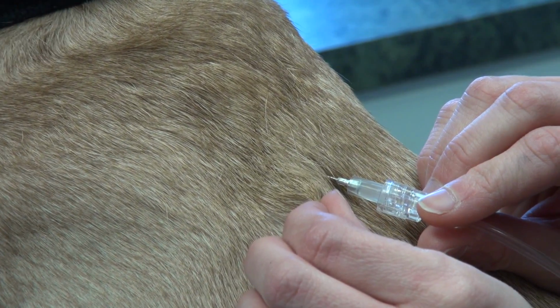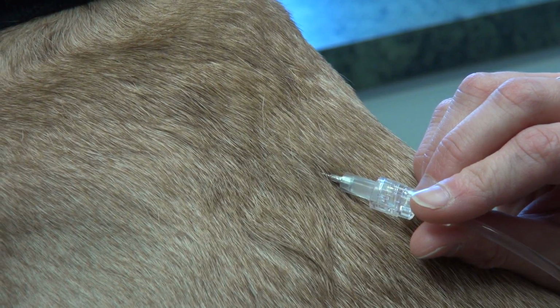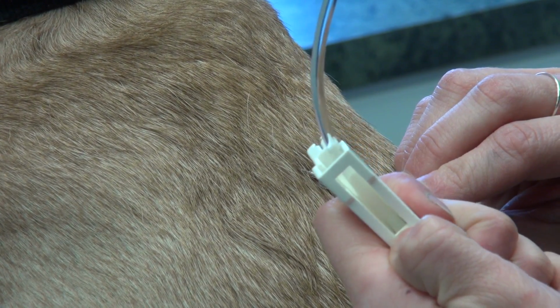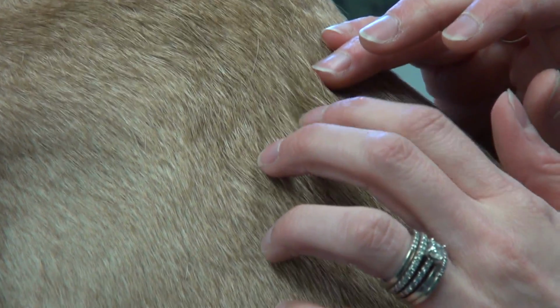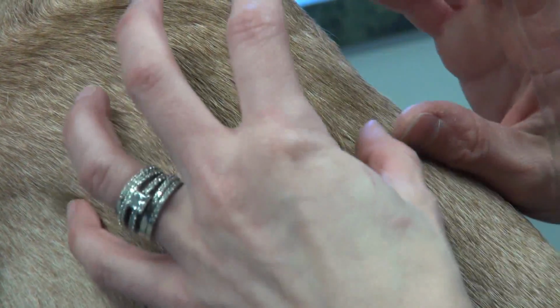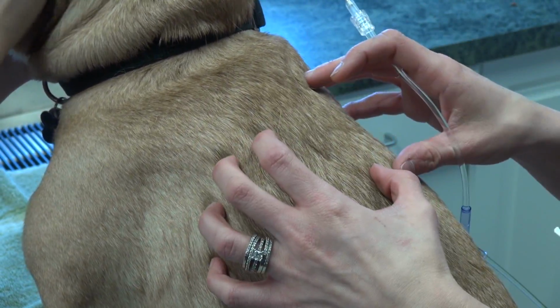with water, with the saline. And then when you're done administering the fluids, you're gonna clamp off this one or the green one up top, clamp it off, take it out, and then just hold your finger on it. It is normal for fluids to leak out a little bit after. That's absolutely normal. And then they're gonna have a little bit of the fluid pocket for a couple hours after until they absorb those fluids.